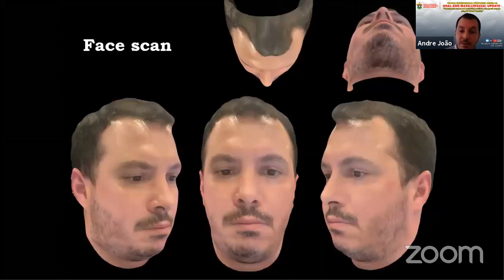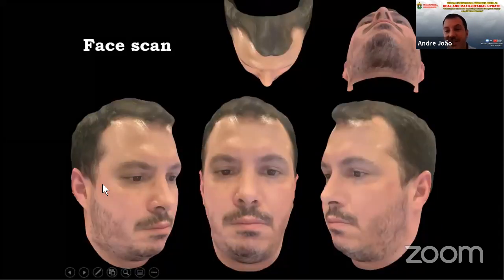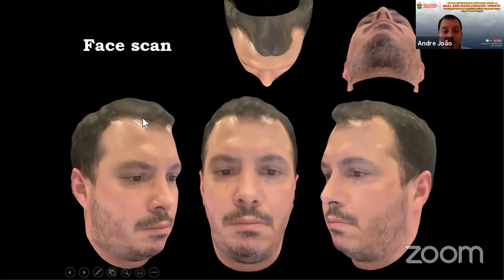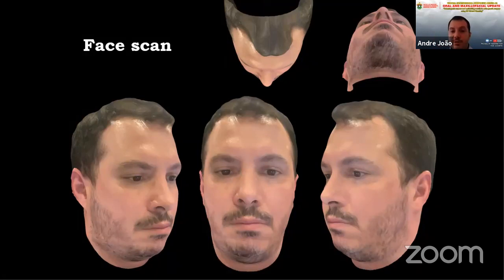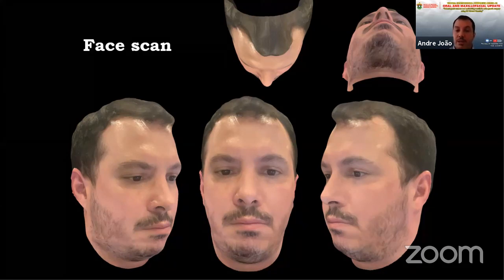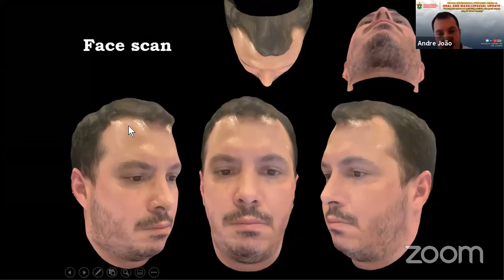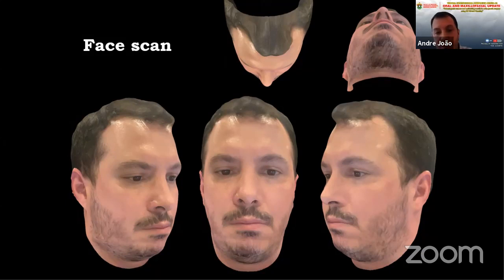Okay, and now, I haven't used it yet. This is me, I only took this, but we also have a surface scan. It also helps a lot because we're talking about a 3D environment. When you take the CT scan, you get a 3D model, and you can superimpose these 2 structures, the 3D model with a face scan, and it's going to help you plan your treatment. I haven't tried this yet in orthognathic surgery, but probably soon I'm going to do this.